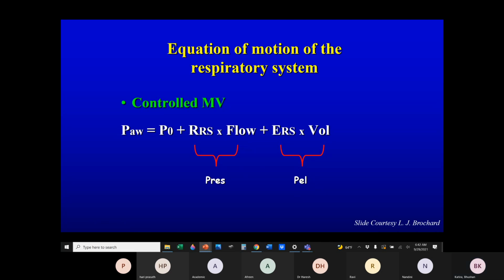So if we remove the flow, as we said in the previous example, that if you keep getting the flow out, that means there is no flow in the ventilator, then by this equation the resistive pressure goes out. In the absence of flow, it does not mean that airway resistance disappears, but the pressure for the airway resistance will disappear, because since there is no flow, there is no gradient, so this pressure becomes zero. There certainly is resistance still present, but you're not now measuring it on the ventilator.